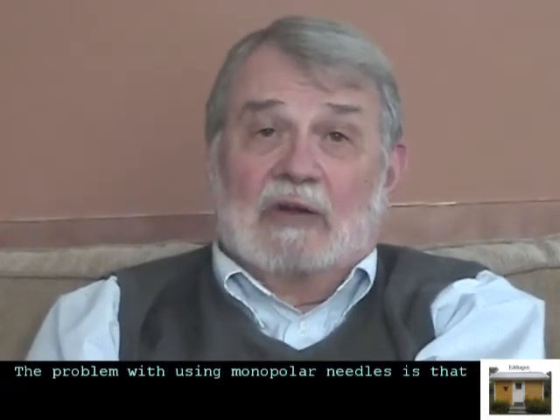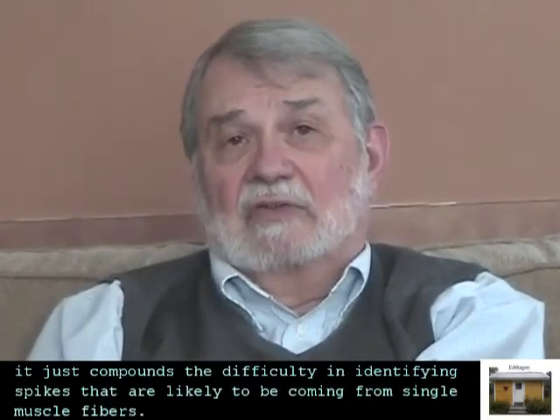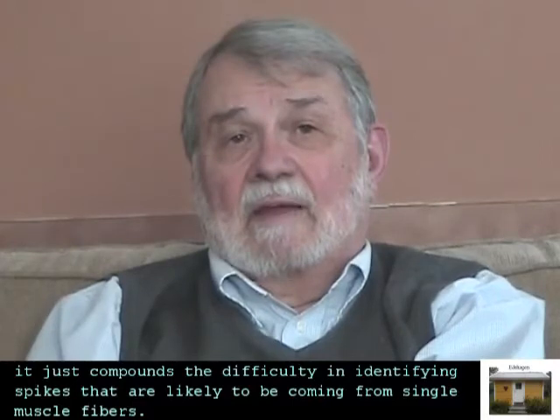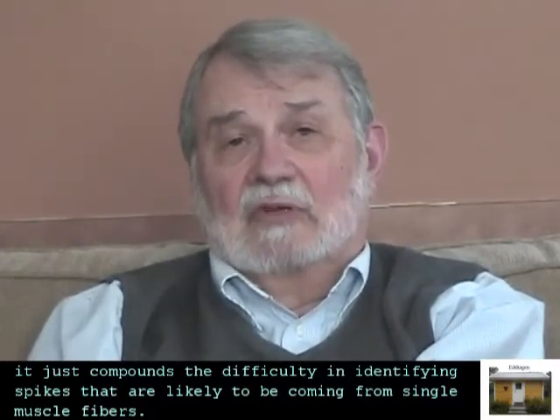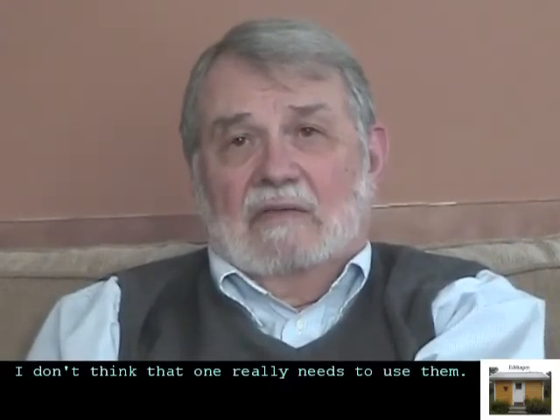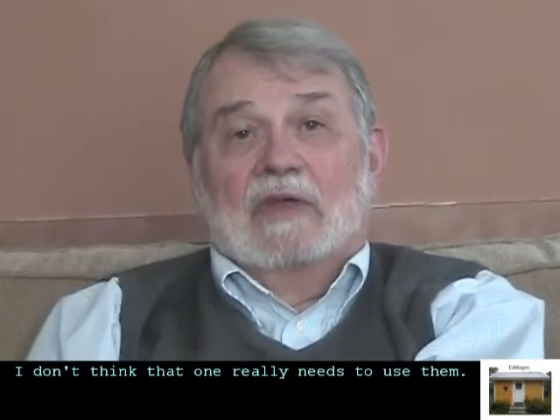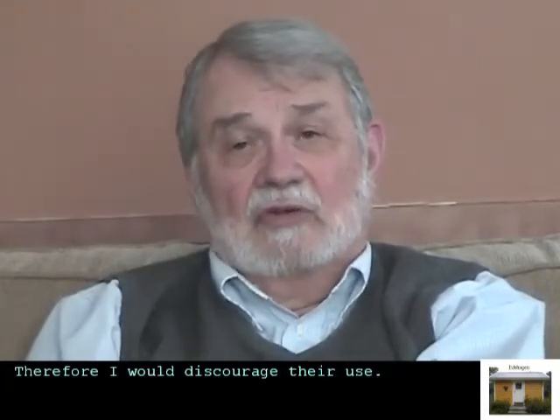The problem with using monopolar needles is that it just compounds the difficulty in identifying spikes that are likely to be coming from single muscle fibers. And I don't think that one really needs to use them. Therefore, I would discourage their use.